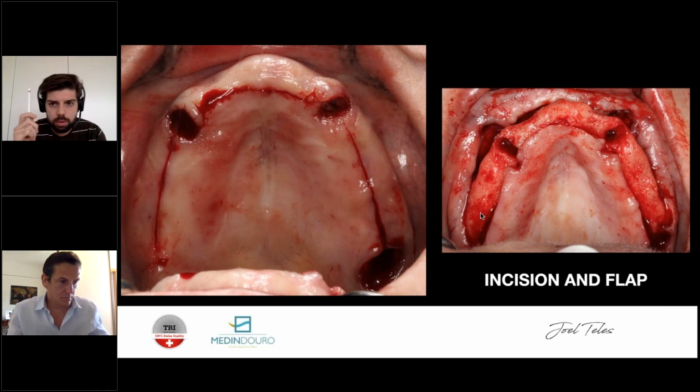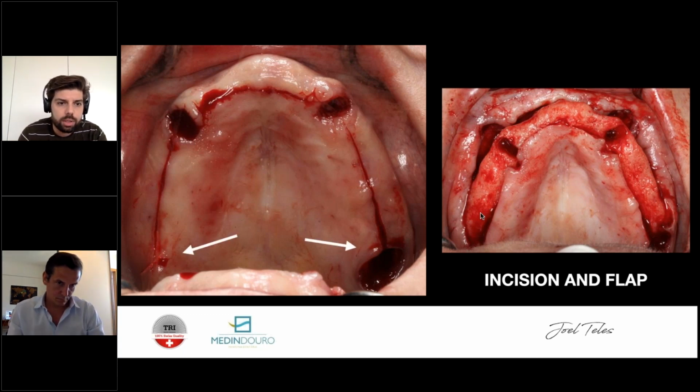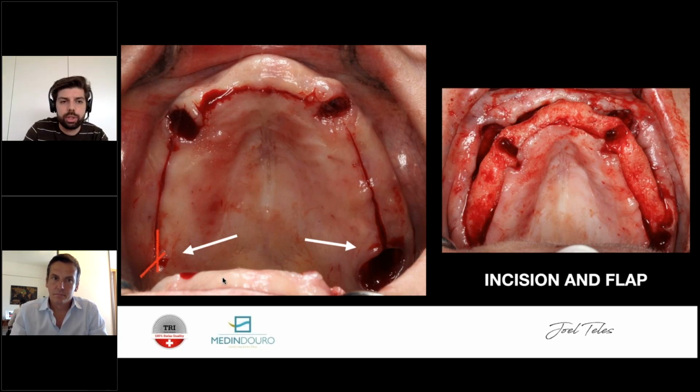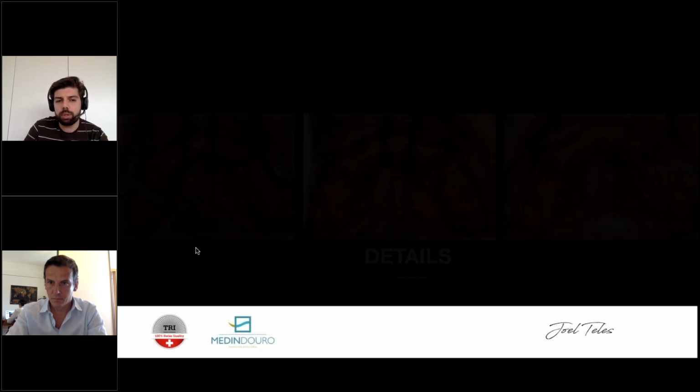A lot of questions about this, about those two incisions there, those cross incisions on the bottom, and why were they important? It's very important, especially in really resorbed jaws, because you start the flap handling from this region here, and you go forward, and the same here. If you don't do it like this and you start somewhere here, sometimes in the concavity that happens in really resorbed bone, you'll end up puncturing your tissue or damaging it. So you'll end up with not so proper healing. And here the cross has to do with blood supply, so that you don't get necrosis on that part. Okay. So it's a very small tip, very important in resorbed jaws.